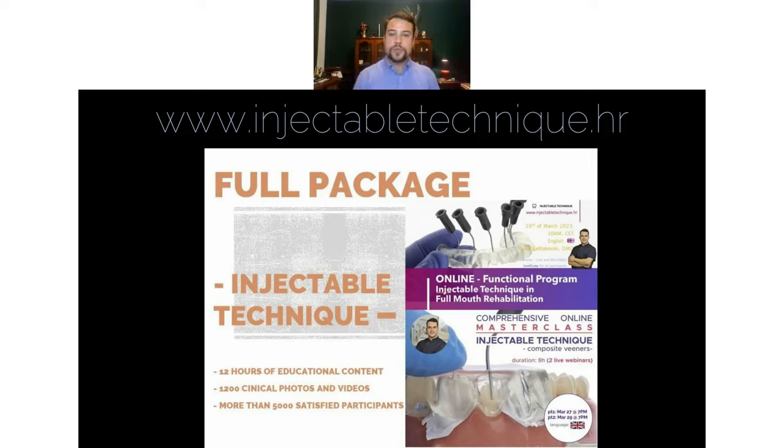Do you recommend working with rubber dam in front teeth? Well, you can, but rubber dam will cause you problems with the fitting, and it will be more challenging for you. Even without rubber dam in the anteriors, you can isolate properly and not have problems with the isolation. For the distal, I would advise rubber dam. For the anteriors, if you are super addicted to the rubber dam, go for the rubber dam, but have in mind you will need to cut the transparent silicone differently and have less stability of it.